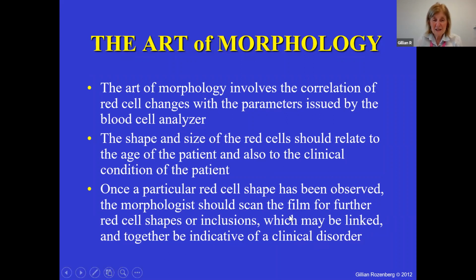I thought I might not say this on this PowerPoint presentation, but I'm just going to say this because I think it leaves a bit of an impact on you. There used to be an ad on the television about a particular dress shop, and it used to say, this goes with that. And it's basically what morphology is about. So you can mix and match according to the tops or the skirts, whatever you wear from this particular dress shop. And it's the same thing in blood film morphology.